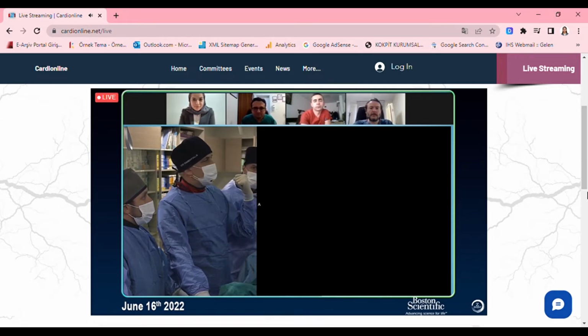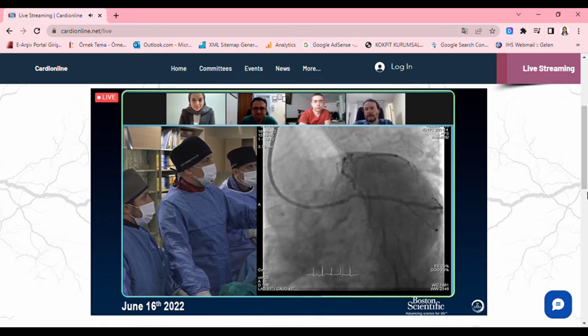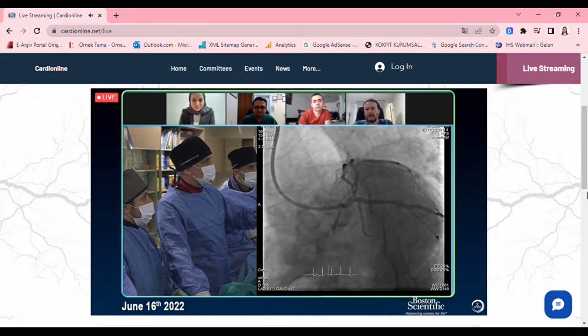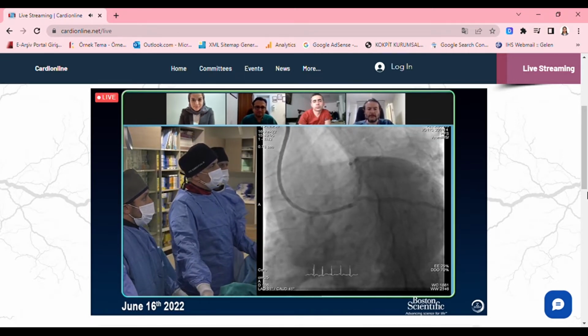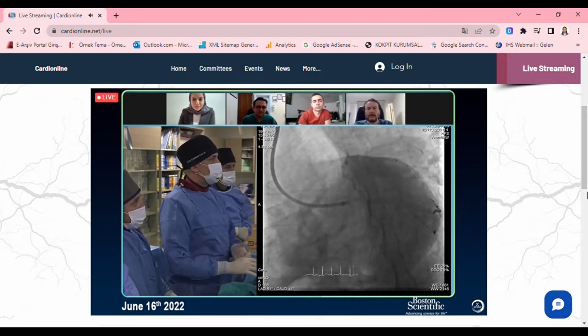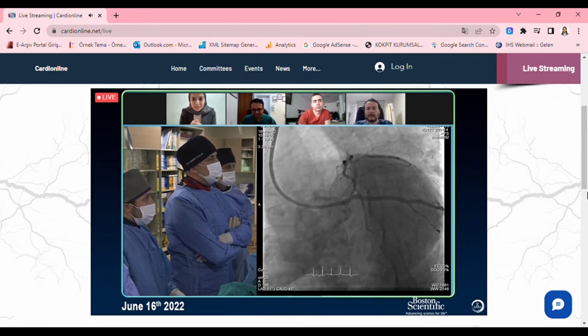Can you come back to the spider view, please? In here, what do you think about the ostium of the LAD? It looks definitely calcified, but also there is moderate stenosis at the ostium of the LAD. Do you agree with me on that? Yeah, I agree.